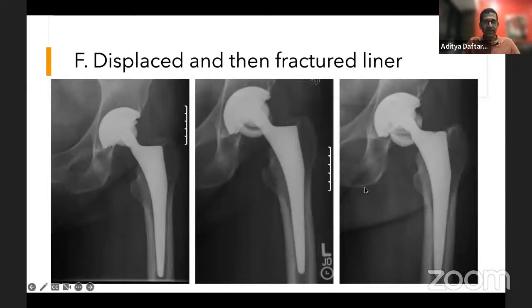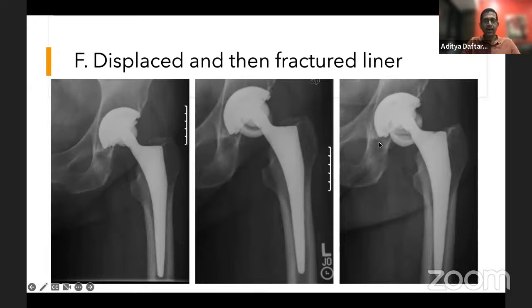Here's an interesting ceramic hip prosthesis case. A follow-up X-ray shows the liner has slipped out of its expected location — not within the cup. Further examination shows a linear lucency through the liner, essentially a fracture through the ceramic cup. This is a nice example of how liner can displace and ultimately fracture.